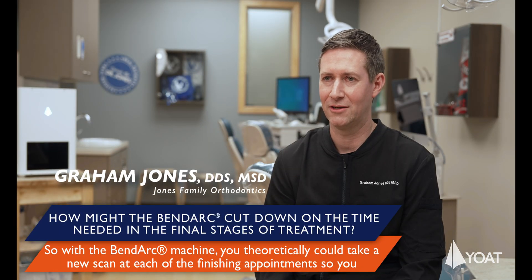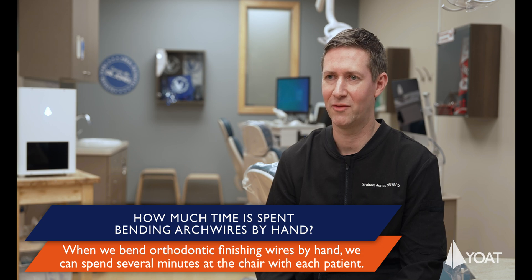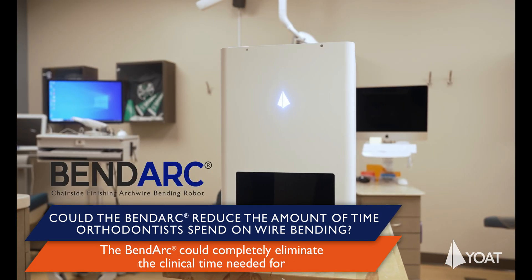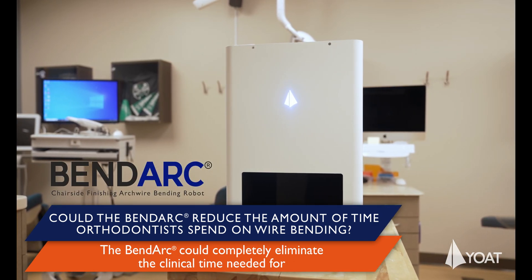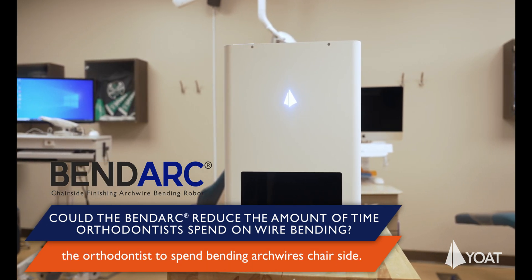With the BendArc machine, you theoretically could take a new scan at each of the finishing appointments so that you could create a new finely tuned arch wire at each step along the way when you're finishing a patient's treatment. When we bend orthodontic finishing wires by hand, we can spend several minutes at the chair with each patient. Daily I'll usually see about 10 to 20% of my patients who are in the finishing stages. The BendArc could completely eliminate the clinical time needed for the orthodontist to spend bending arch wires chair side.